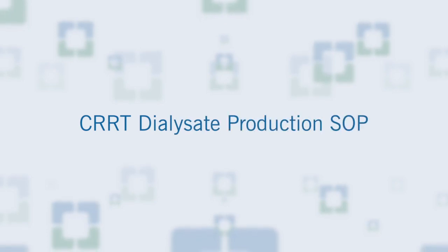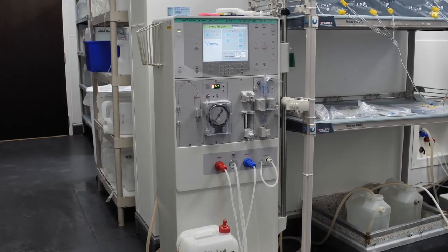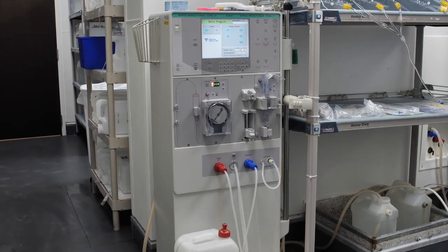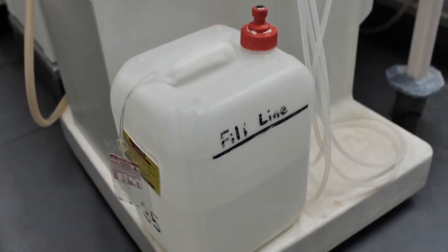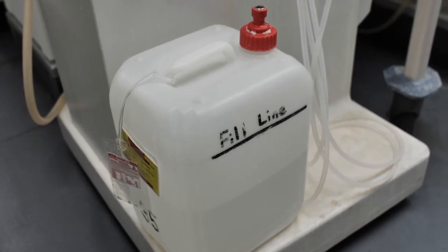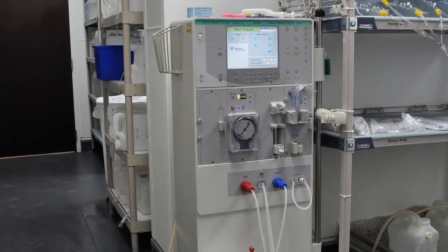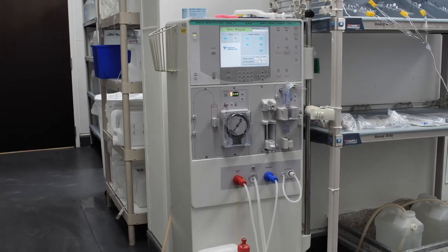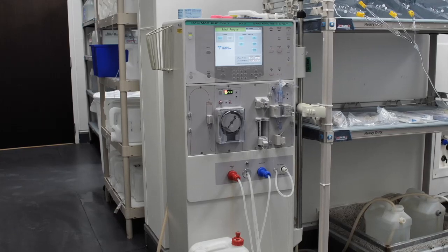This is the CRRT Ultrapure Dialysate Production SOP. The solution is prepared using a volumetric single-pass dialysis machine. Fresenius 2008-T and K2 are used here. These single-patient proportioning dialysis machines use two concentrates, acid and bicarbonate, and mixes reverse osmosis product water with the concentrates to create dialysate.